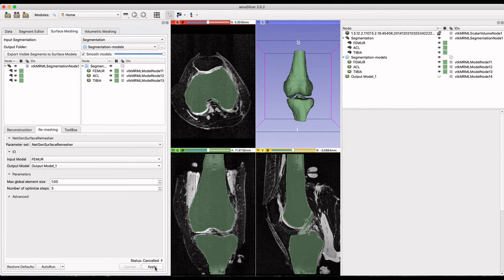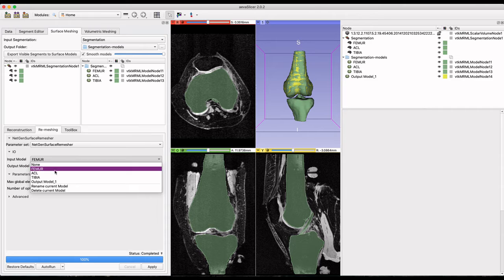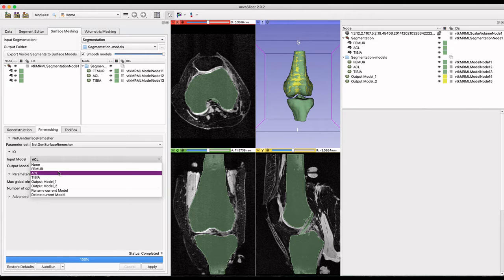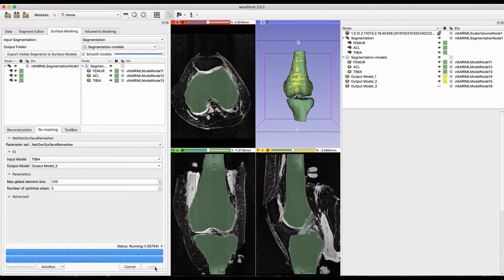At the remeshing tab, I'll apply a maximum global mesh size of 1 to each geometry using the NetGen Surface Remesher. Input each mesh and output it to a new model and then select apply.